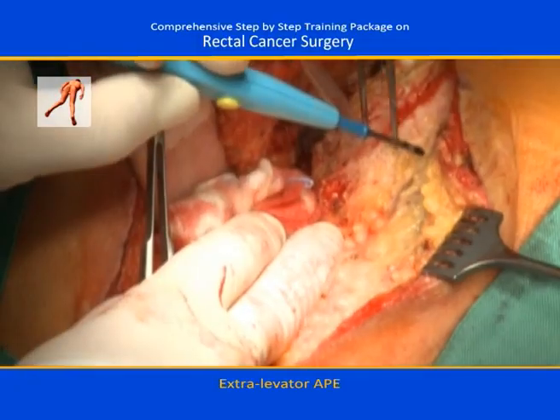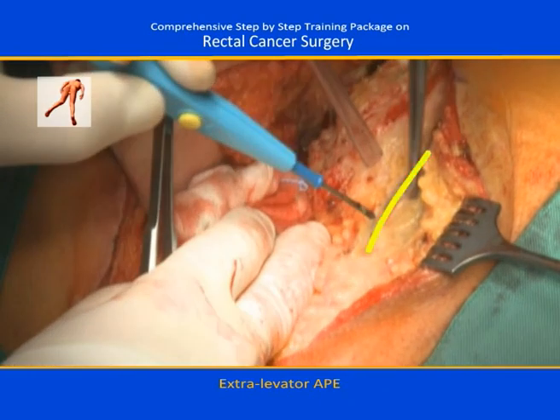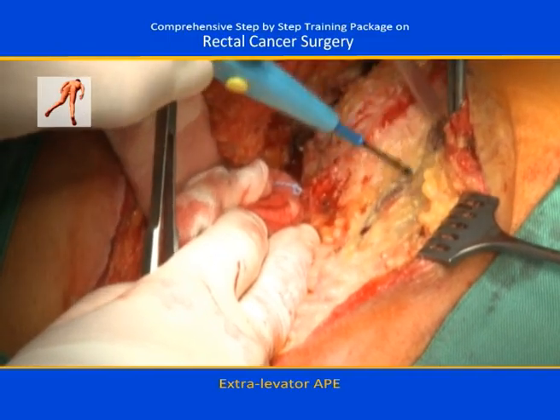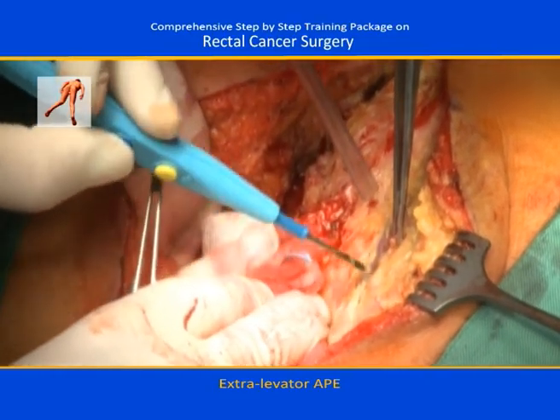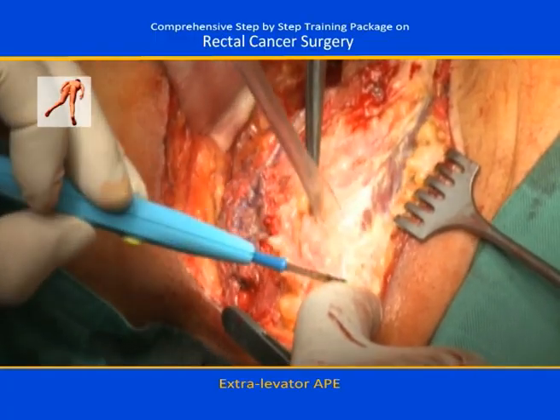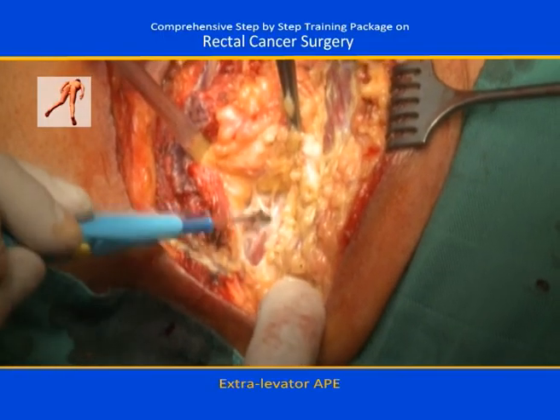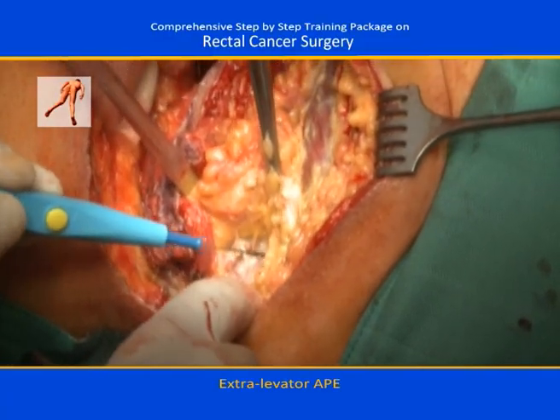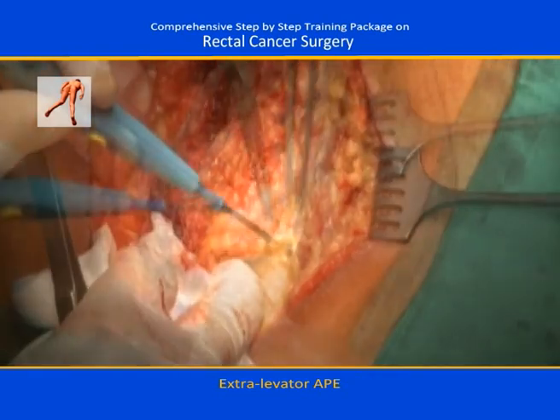Here you can see that we follow the obturator internus muscle, and we try to mobilize the ischioanal fat from this muscle. There is actually a plane between the ischioanal fat and the obturator internus muscle all the way up to the junction with the levator muscle. And by doing the dissection in this correct, well-defined anatomical plane, we can remove all the fat in the ischioanal fossa.